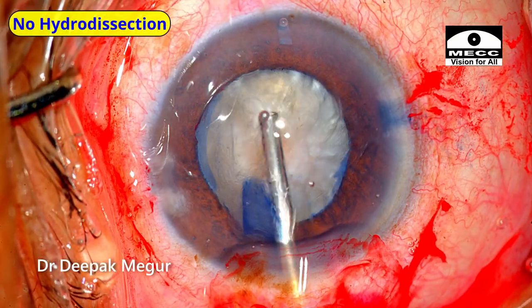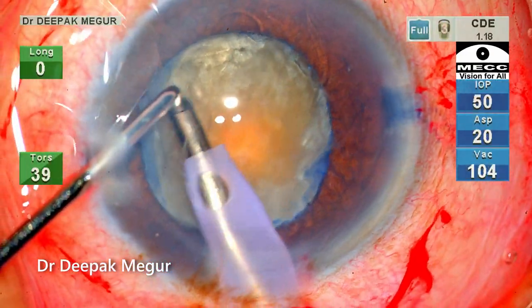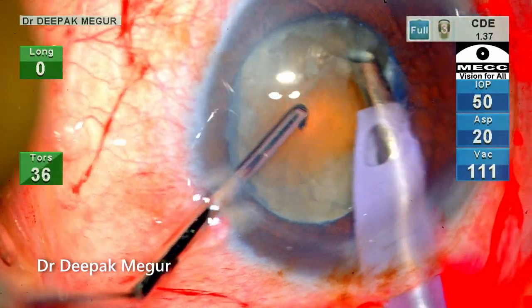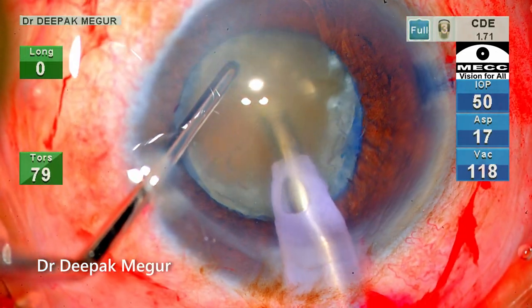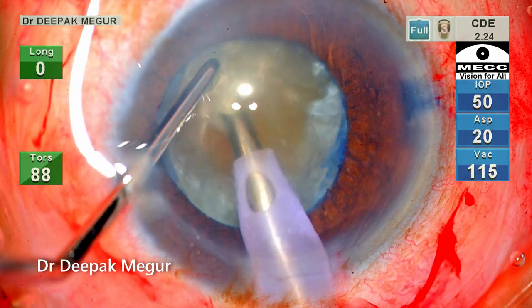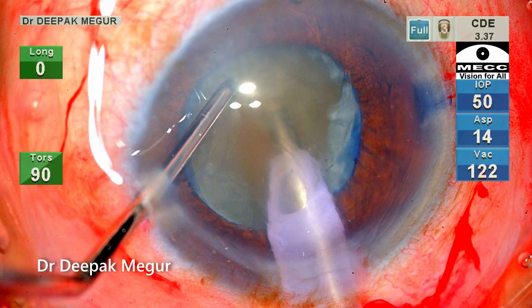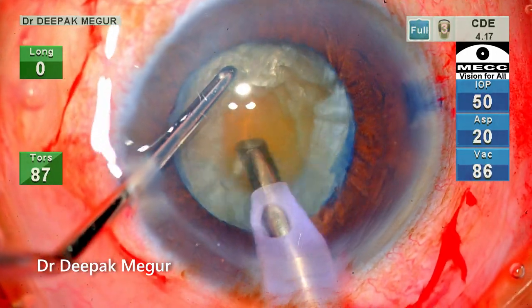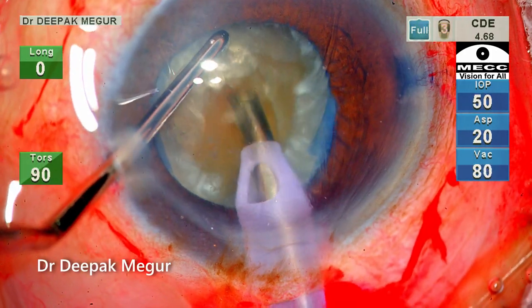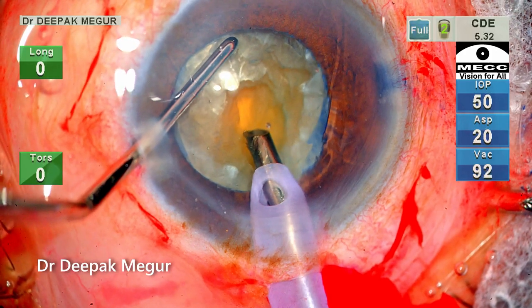So, I'm not doing any hydrodissection because the rhexis is not complete. During phaco, I need to take all the necessary precautions as the rhexis is not continuous now. Strategies would be to maintain chamber dynamics very well throughout the procedure and ensuring that during division of the nucleus, less stress is induced on the torn edge of the capsule. The pupil has also come down in size and I am unable to visualize the torn edge of the rhexis.